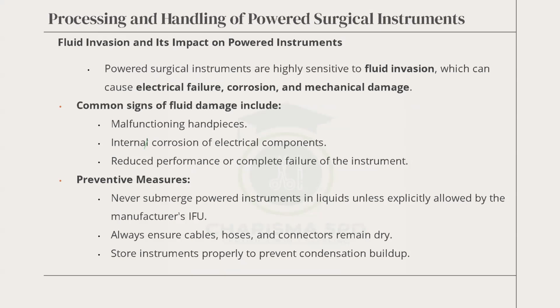Good. Processing and handling of powered surgical instruments. Again, I mentioned that you should not allow water to go into your powered surgical instrument. Very expensive. So don't leave them in the water soaking and then go for lunch. A lot of the time, that's what happens.